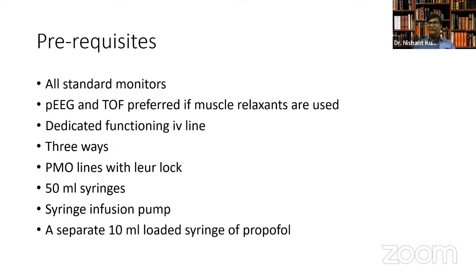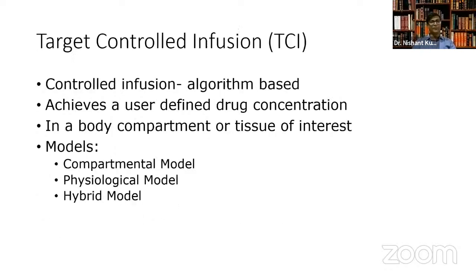You require a dedicated functioning IV line, with three-way stopcocks with Luer lock, that is important. 50 ml syringes, syringe infusion pumps or a TCI pump, and a separate 10 ml loaded syringe of propofol just for emergencies, just in case you require to boost up the depth a bit.